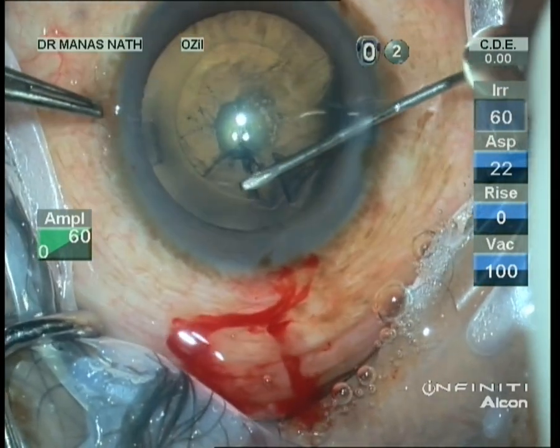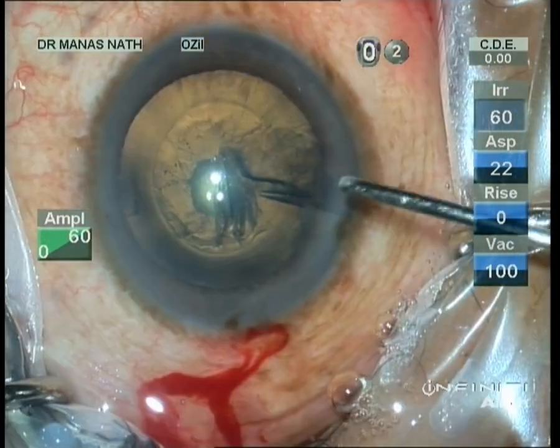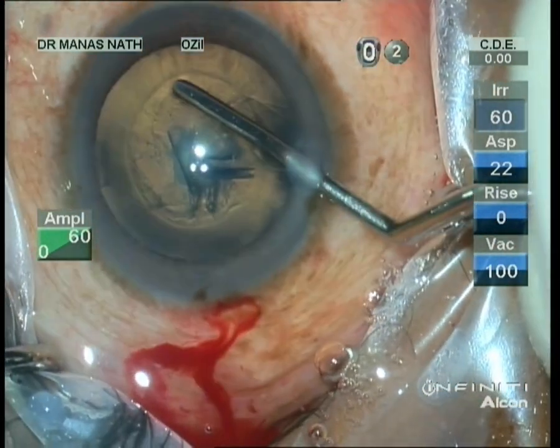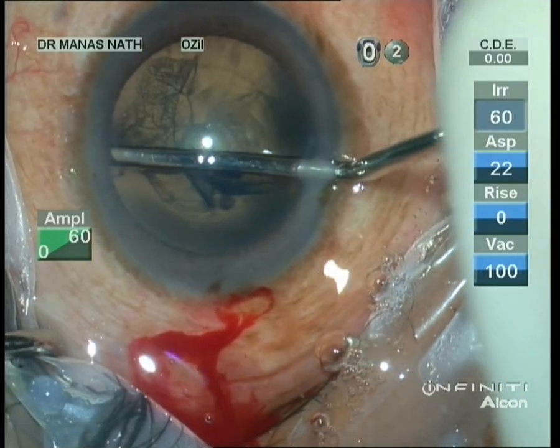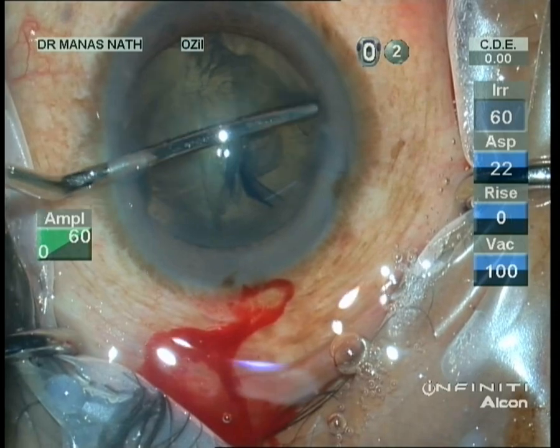The capsulorrhexis has been completed now. As we have to avoid hydrodissection, I am using a spatula to separate the cataract from the undersurface of the capsule.